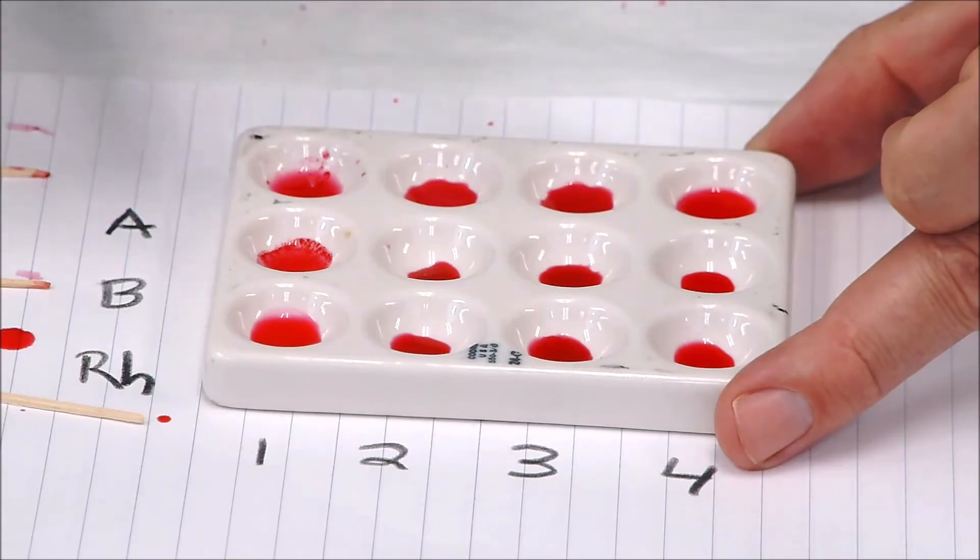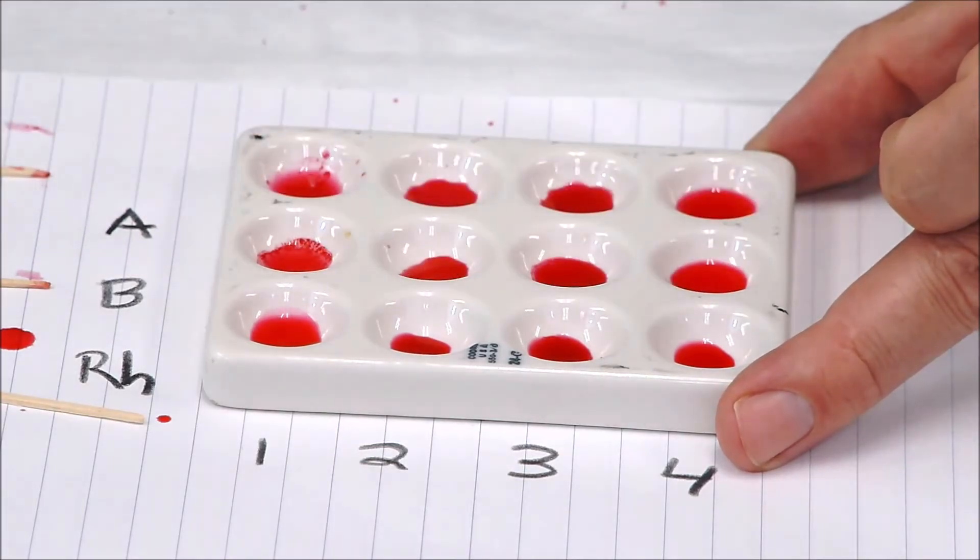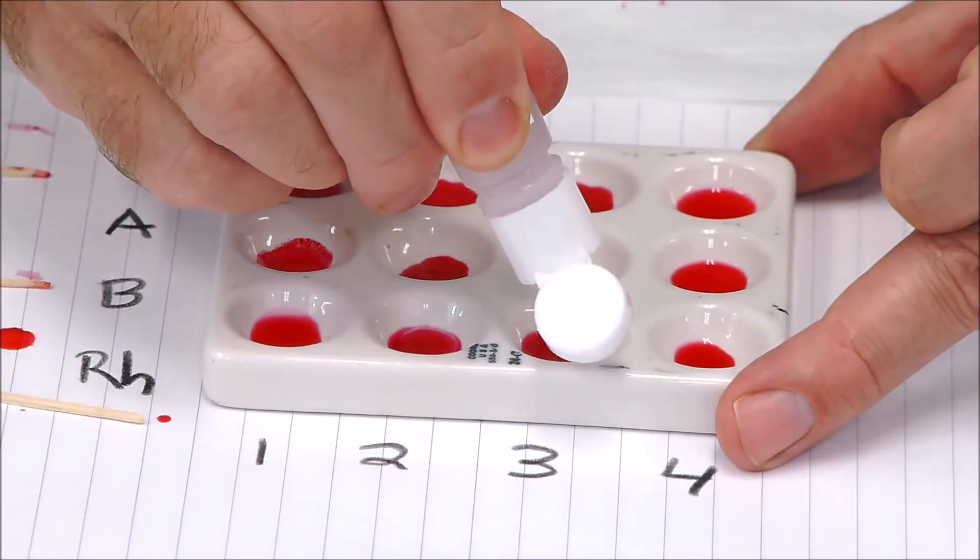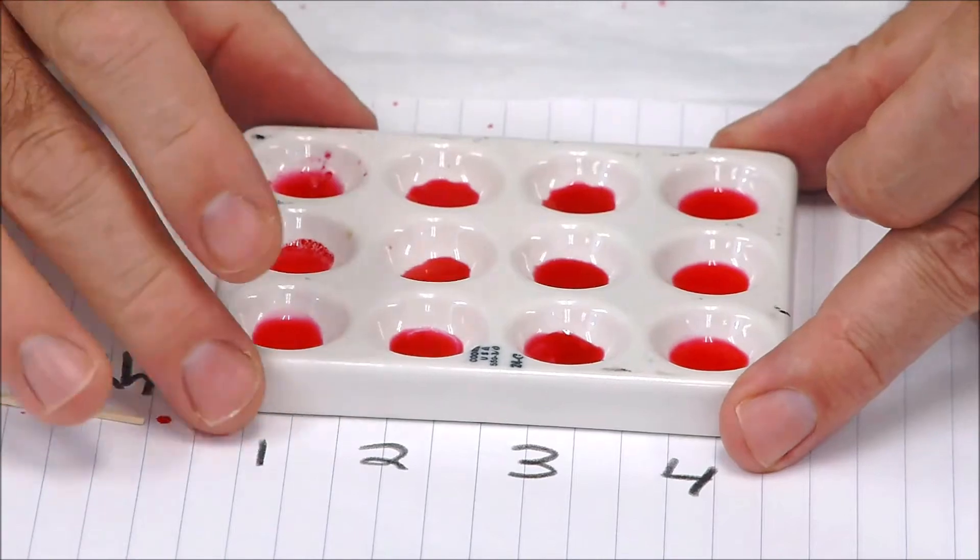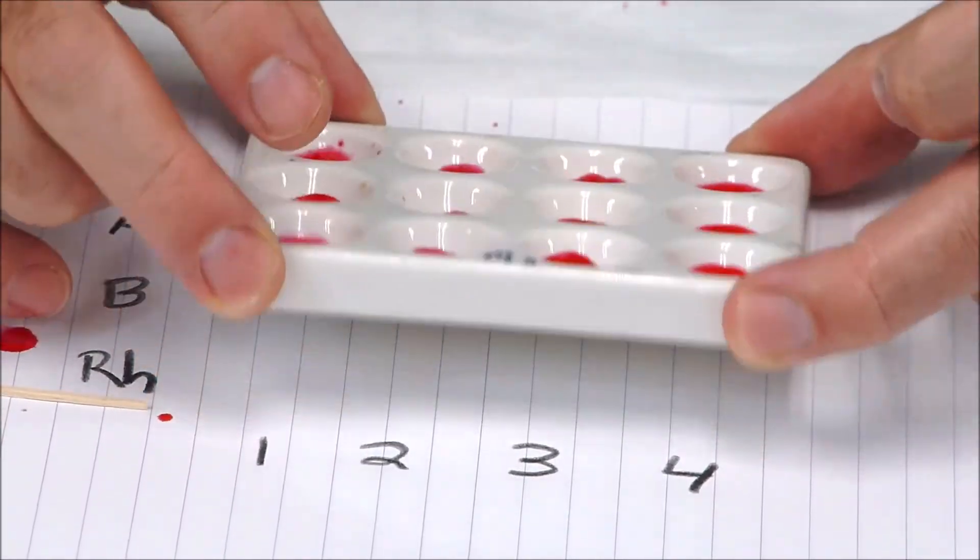And then finally the anti-D for the Rh. Okay, and again we're just going to agitate those as much as possible without getting any cross-contamination by going into adjacent wells.